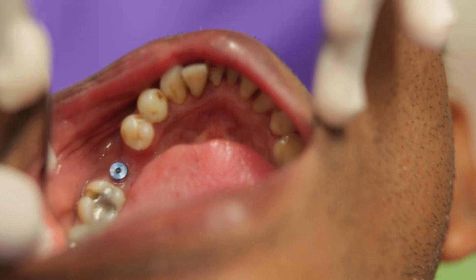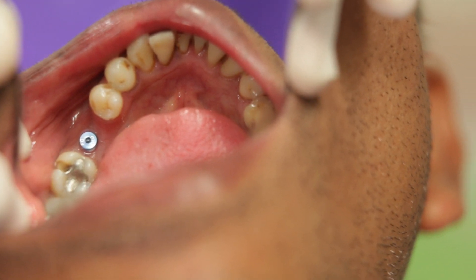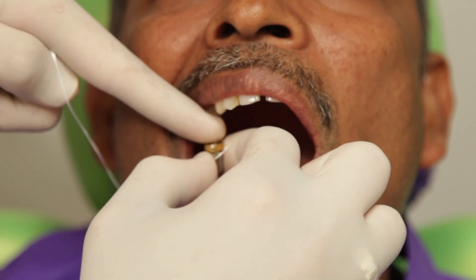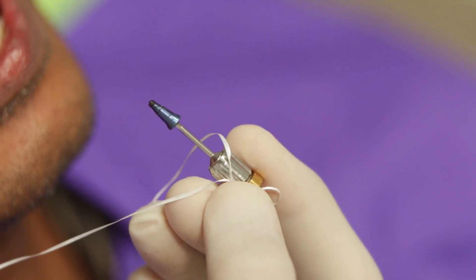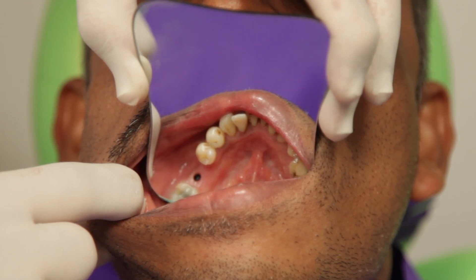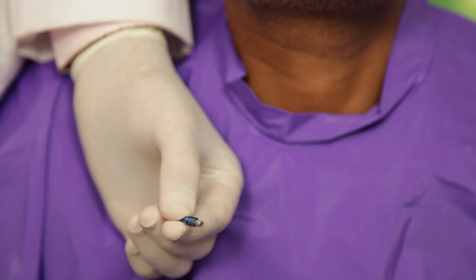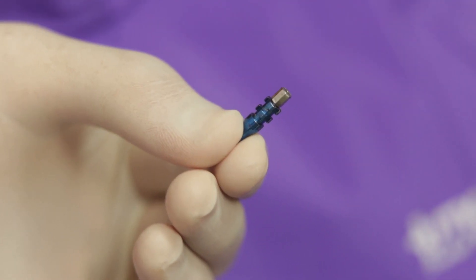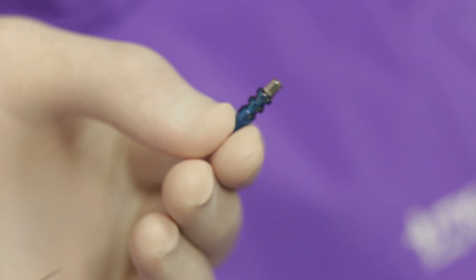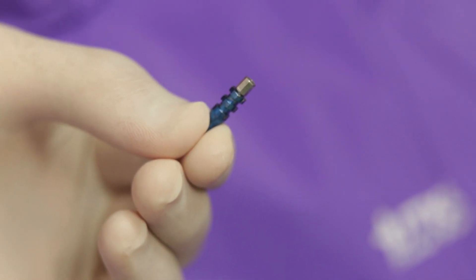Now this is another case where I will take an open tray implant impression for another Biodenta implant. Notice how I have a piece of floss tied around my hex driver which will prevent any accidents. You can also see that there is a nice collar formed around the implant. I am going to take an open tray impression post of the corresponding size — in this case it is a B2. This is what the impression post basically looks like.